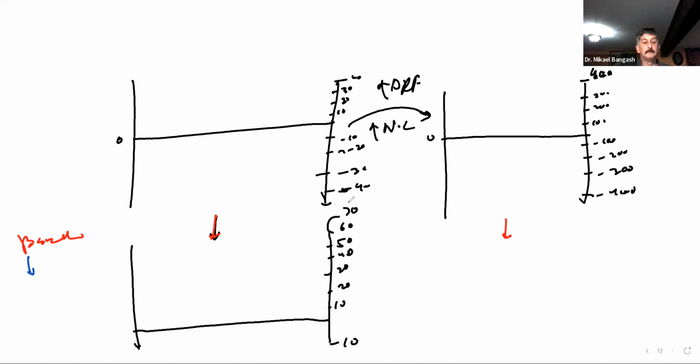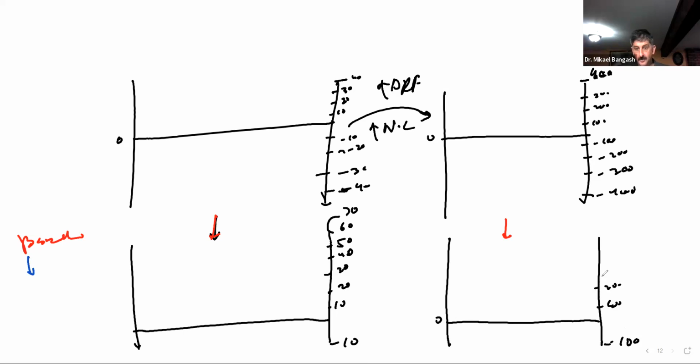Did that make sense? Whereas this here, that's where you had your Nyquist limit at 400 to minus 400. Let's say we do a similar baseline shift, just bringing the baseline down. Yes, this will become your new baseline, which will be 0. We can record up to minus 100, and this will be 100, 200, 300, 400, 500, 600, and you can see it's 700.